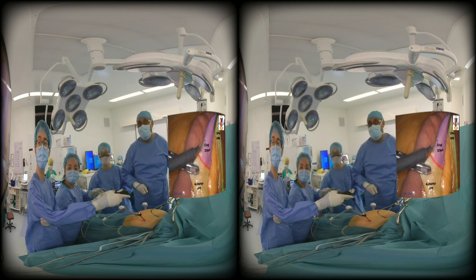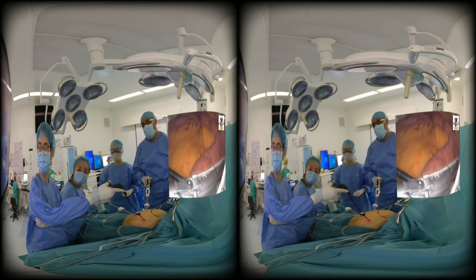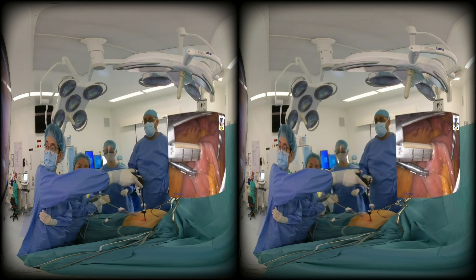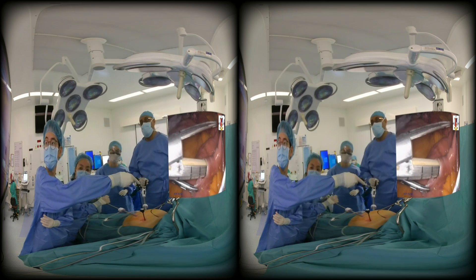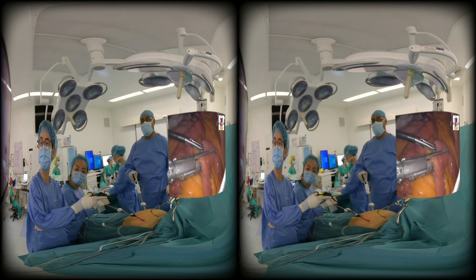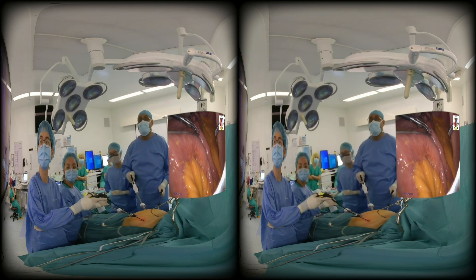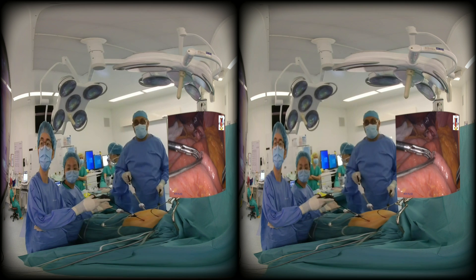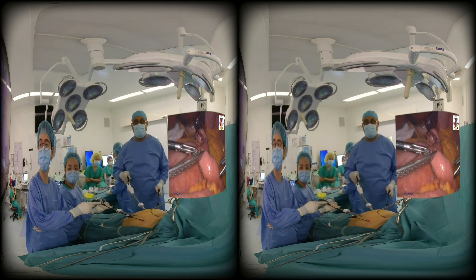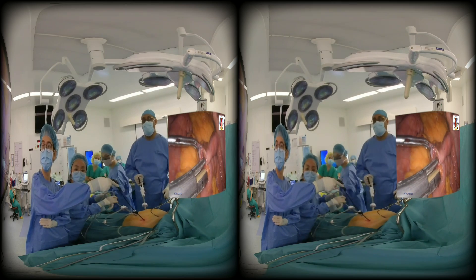I hold the proximal or the alimentary limb, create an enterotomy, dilate the enterotomy, and do a side-to-side anastomosis using a 60 vascular reload. This is a bit tricky — you hold both loops of bowel, one in your stapler and one in the other hand. Once you engage the enterotomy and have both jaws into the bowel, the assistant will take over the biliopancreatic limb and the surgeon handles the alimentary limb or common channel as required.